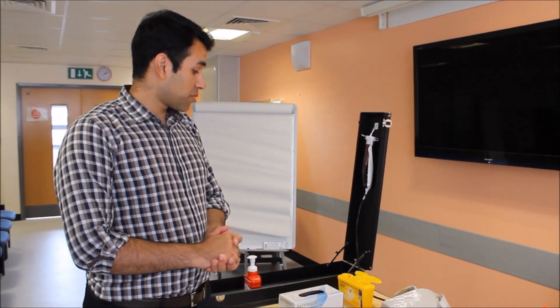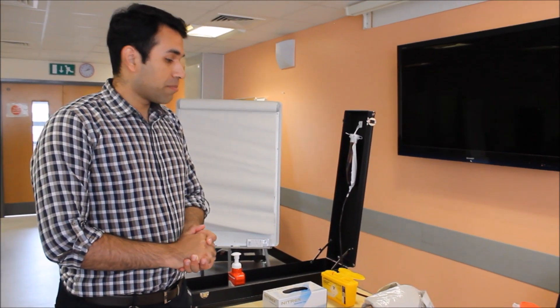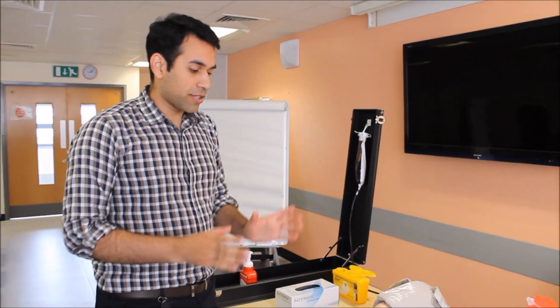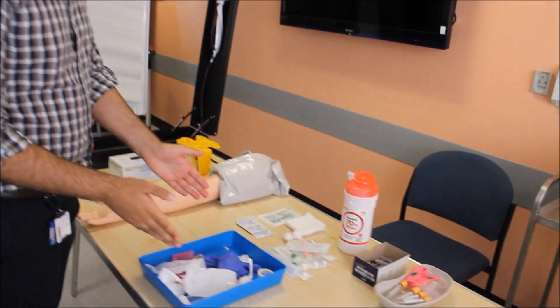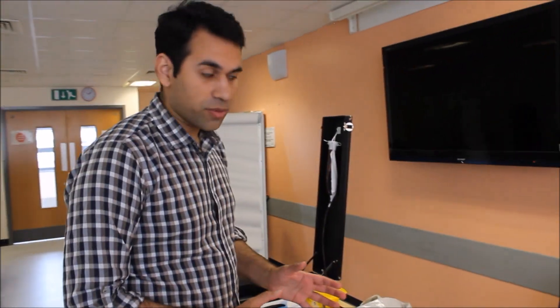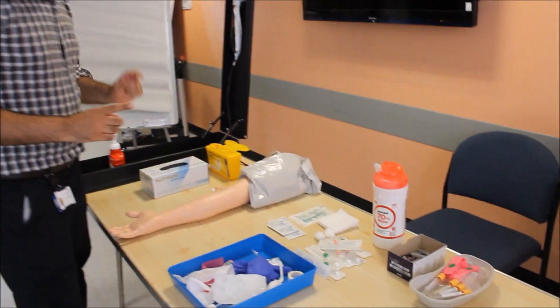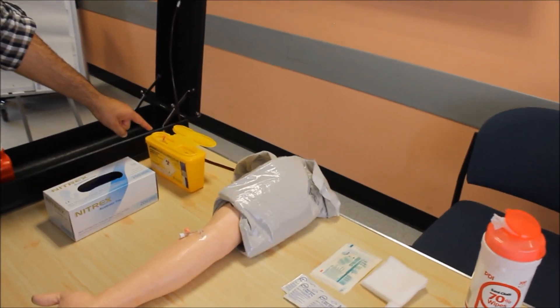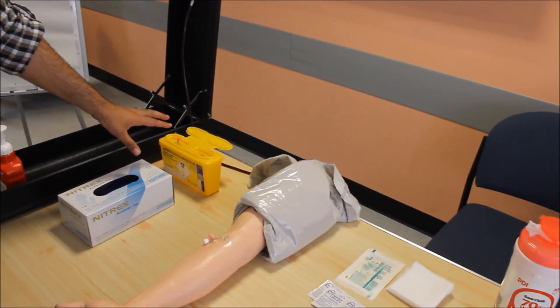Okay, so that was the process of cannulation. Please make sure that you put all of the waste that has been created into the yellow clinical waste bin and also always put the sharps in the sharp bin. This is the most important part.